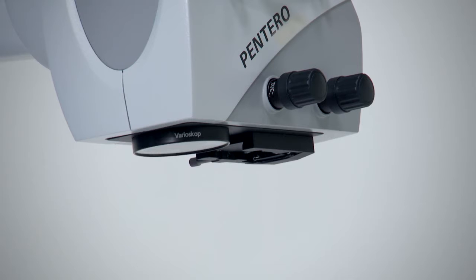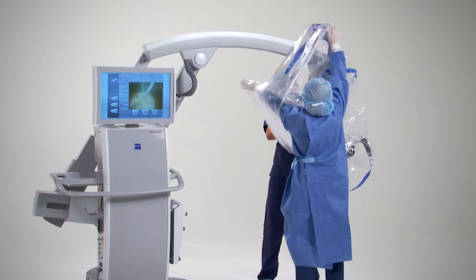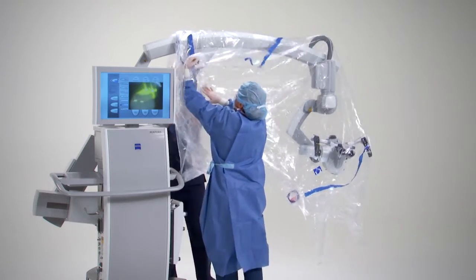The OPME drape has a special lens fitting for the objective. Place the fitting over the objective, and then move the drape over the head of the microscope and handgrips.